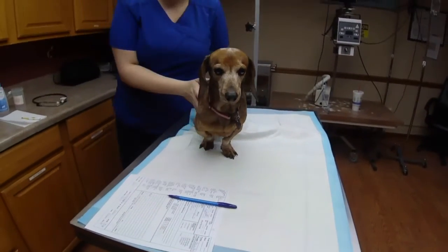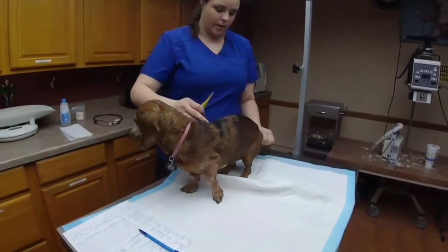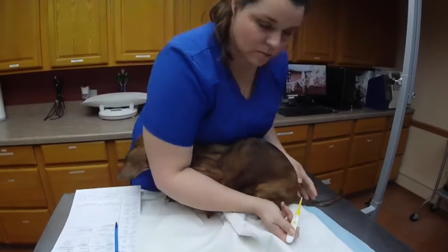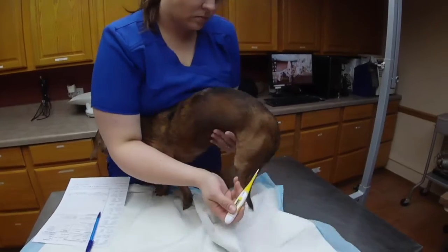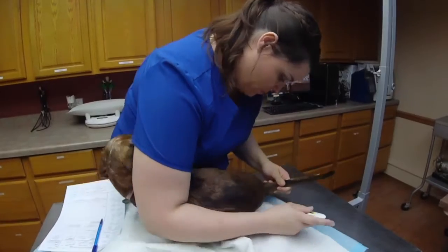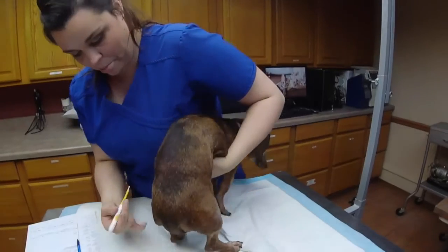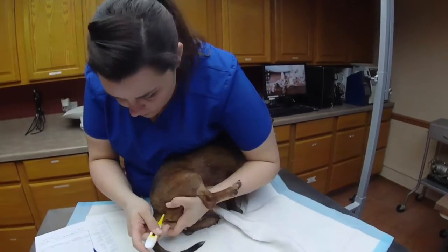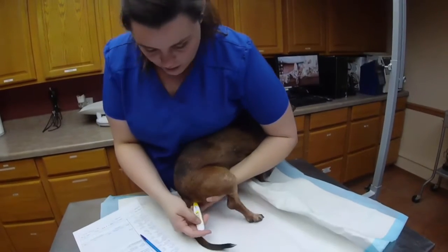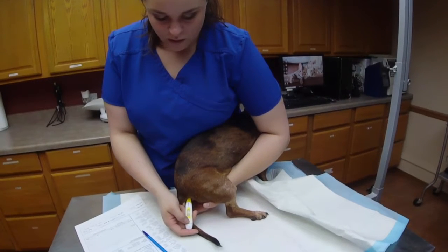And then we will go ahead and get her temperature. I have a thermometer ready here. I know, Heidi girl. You're okay. Hey, Heidi. You're just not gonna do this? Is that what we're gonna do? Heidi. Here we go. I may have to edit some of that out.